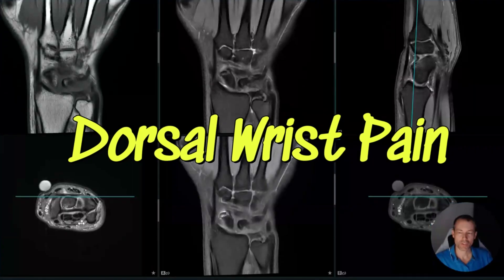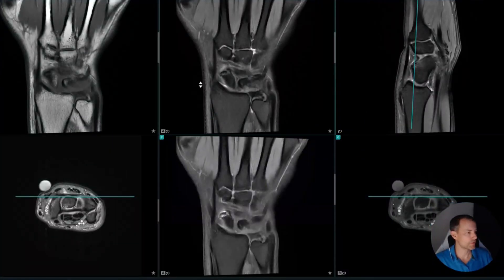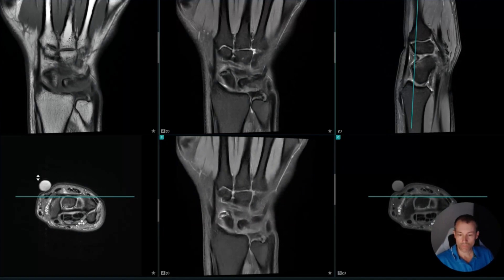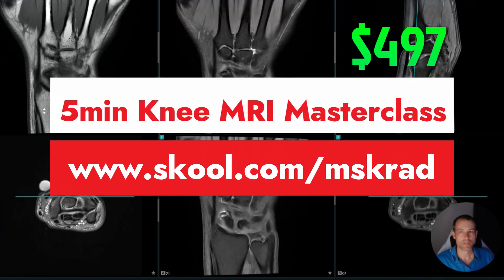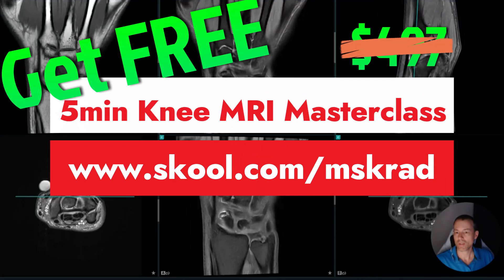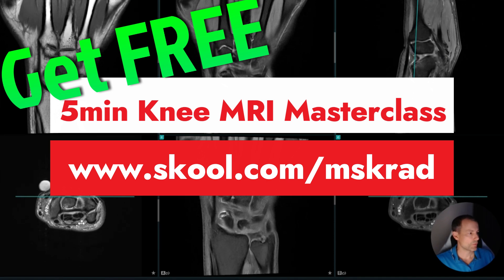Hi everybody. I just want to share a lovely case here that I just saw. It's a young patient, a gymnast or has been a gymnast for many years, who has chronic dorsal wrist pain. This is the MRI — the ultrasound didn't show much, so let's have a look.